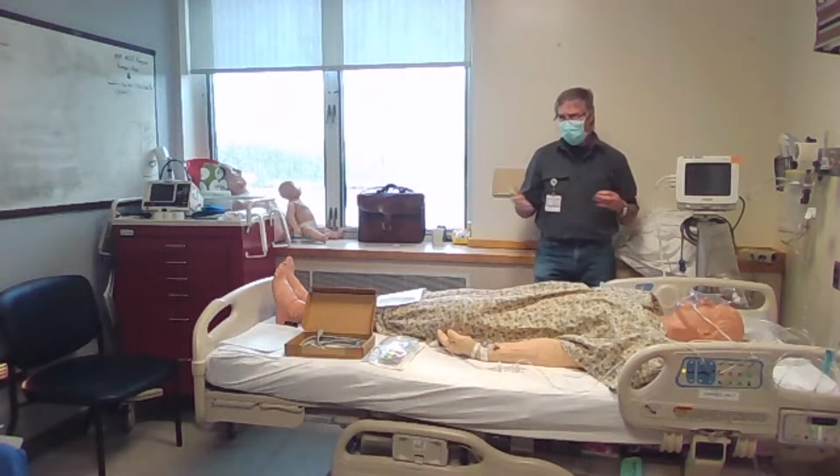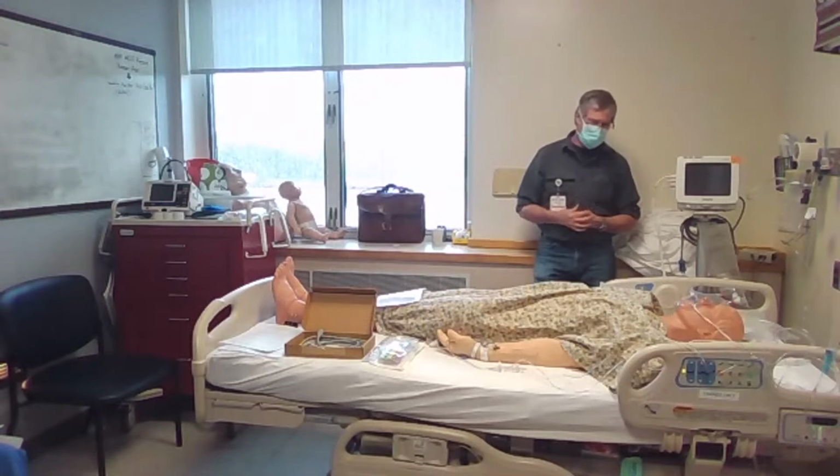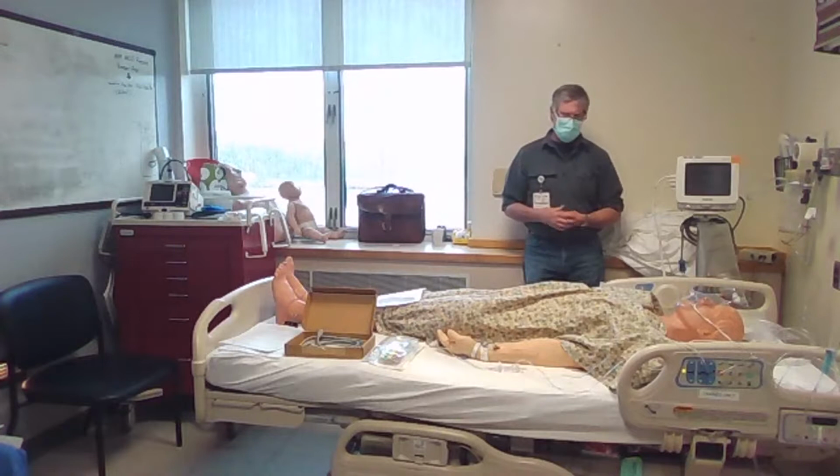When you want to have rigorous control of blood pressure parameters, so carotid artery surgery, surgeries on the brain, any type of surgeries like that. And anytime you're going to do multiple blood gas samples. That's kind of straightforward because you've already got access. You can get into it really easy. I always like to call that one your catch-all, because if you're ever looking for reasons to put an A-line in, you can say, I need to get a blood gas, and I'm there anyway. So it's a really nice way to do it.